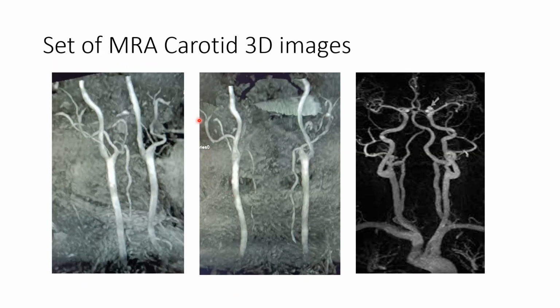This is a set of MRA carotid 3D reconstruction images. After the reconstruction, the images become clearer and provide diagnostic value.